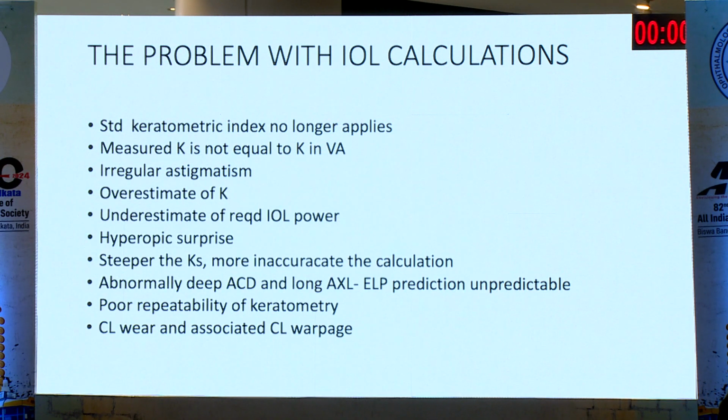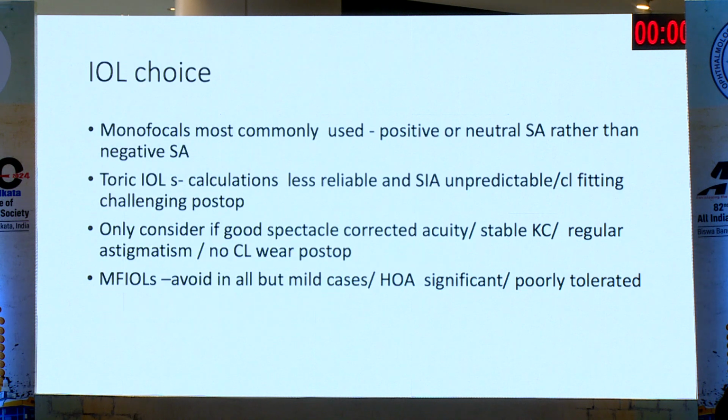The other thing is that you do not have a regular astigmatism. Your principal meridians are not orthogonal, so you have irregular astigmatism. What you're measuring is not the accurate K, and therefore the patient is more prone to refractive surprises. Patients need to take a contact lens holiday, more for rigid lenses than for soft contact lenses.